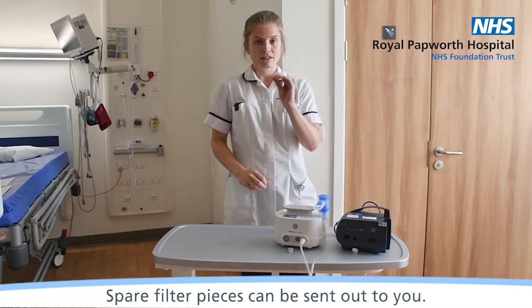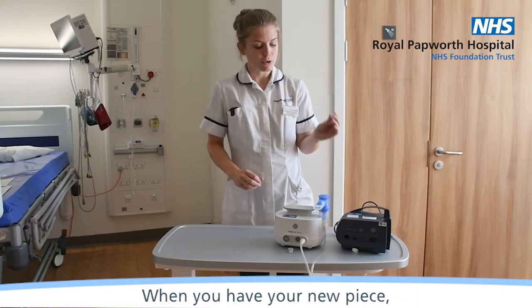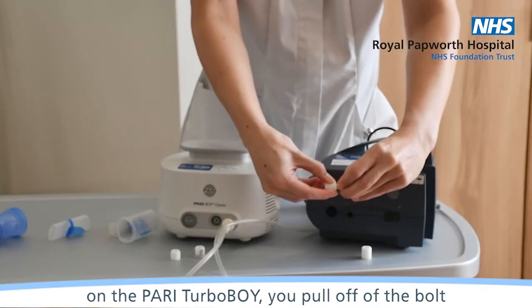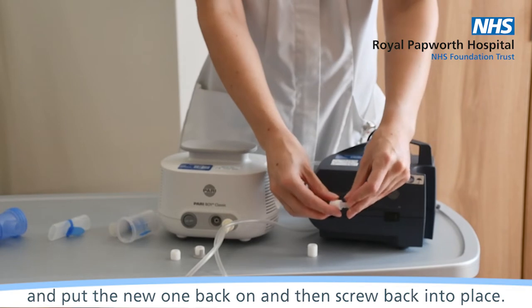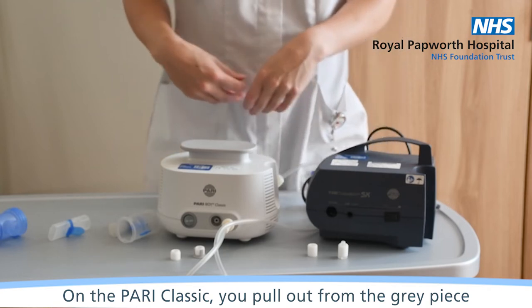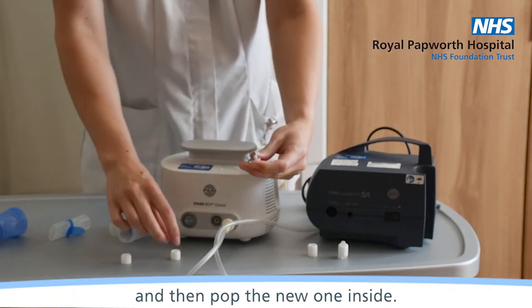In order to get a spare filter piece, these can be sent out to you. When you have your new piece, on the Pari Turbo Boy you pull off the bolt and put the new one back on and then screw back into place. On the Pari Classic, you pull out from the grey piece and then pop the new one inside.